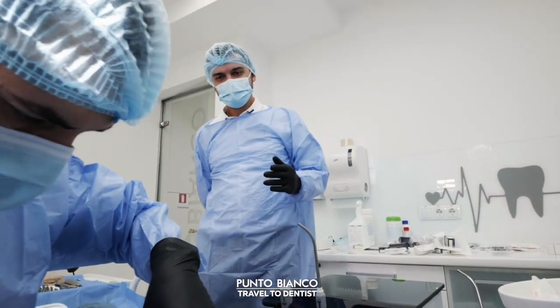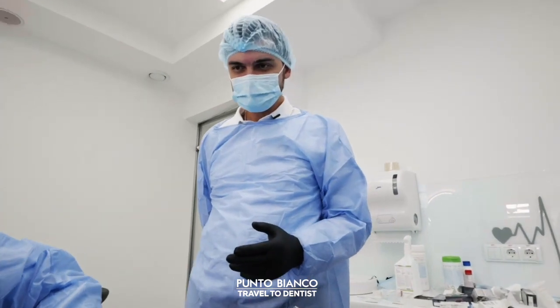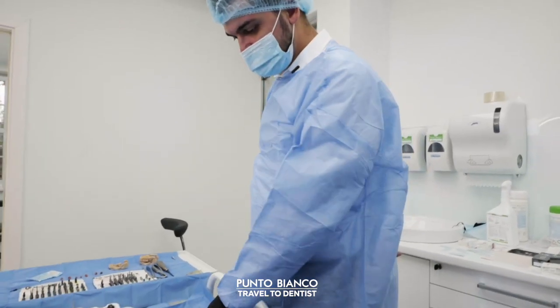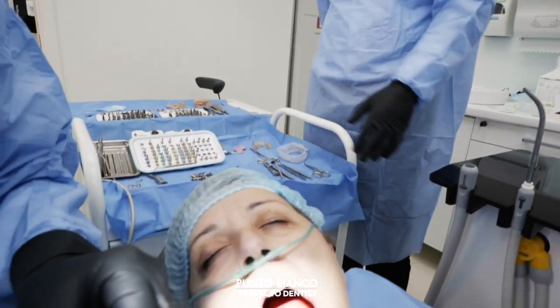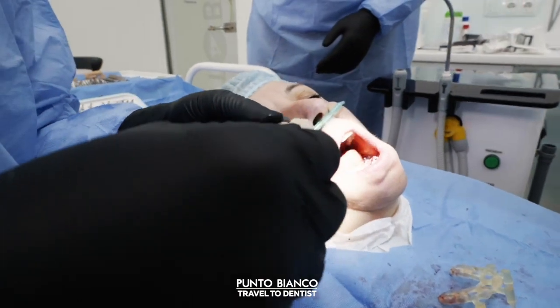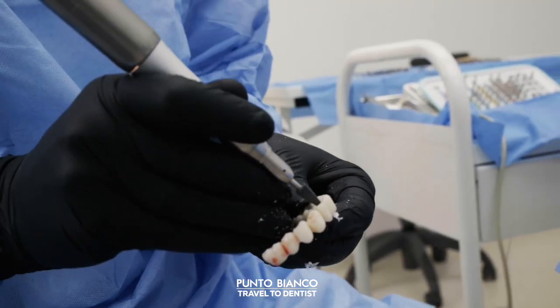The surgical part has been finished, now the prosthetist has arrived. We're checking the position of the multi-units and the individual deviations that will come out through prosthetics. And from what we see, a little adjustment is needed, which will be done now.